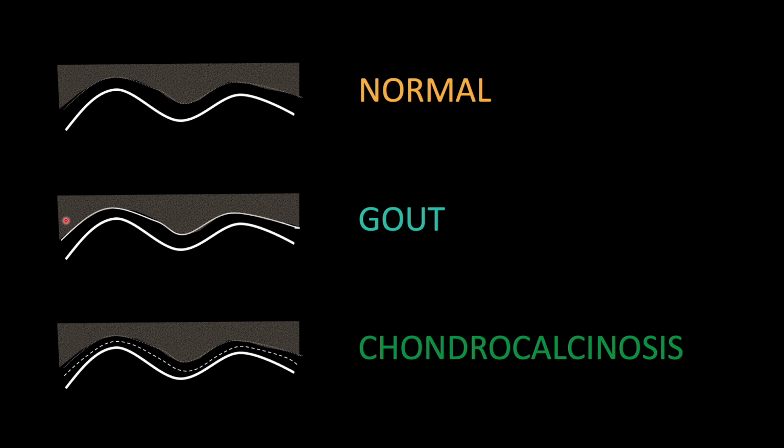If this line above the cartilage is much brighter than otherwise viewed on an unaffected joint in the same patient, that is a sign potentially that this patient is experiencing gout. Because of the crystal deposition that occurs on the cartilage surface, you can actually get a higher reflective index of these ultrasound waves and get a brighter line. So it sort of looks like train tracks. Sometimes they'll call it the train track sign or the river sign.